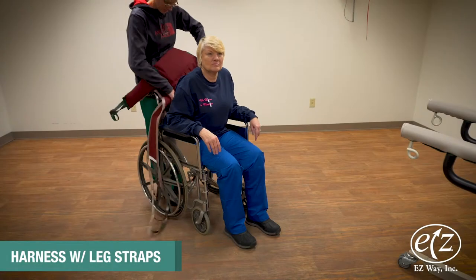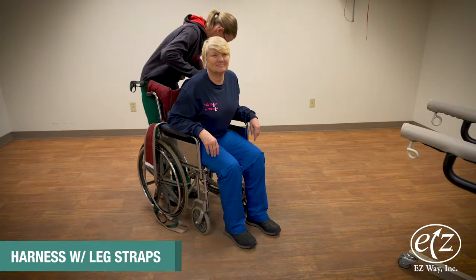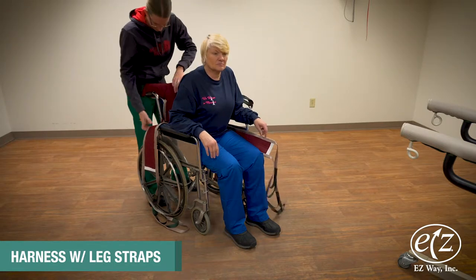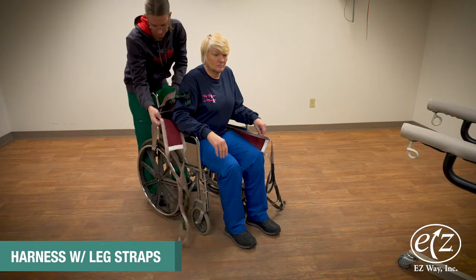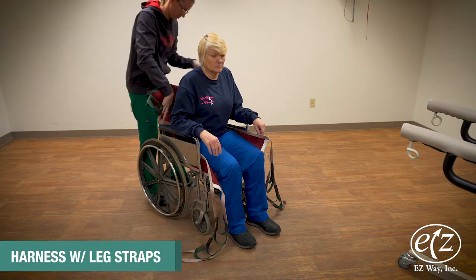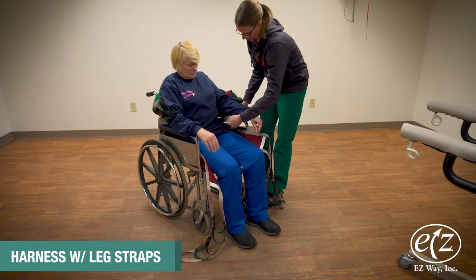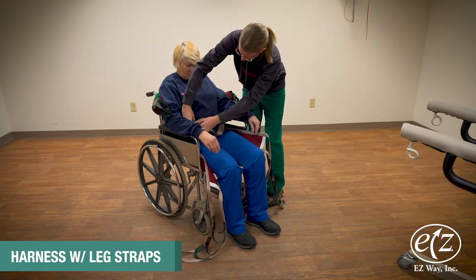With a harness with leg straps in hand, lean the resident or patient forward and drop the harness down to approximately 2 inches below their arms. Securely fasten the safety strap around the patient's chest to a snug fit.